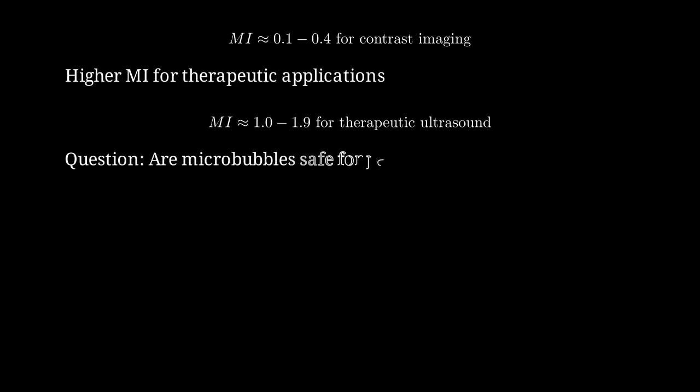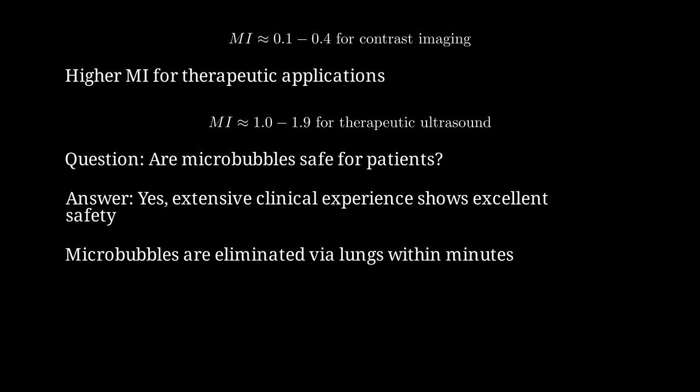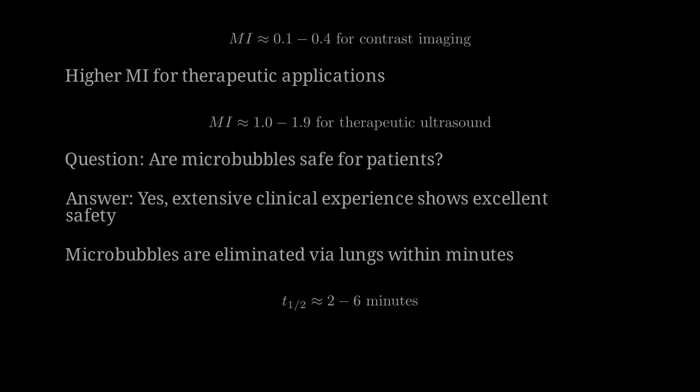An important question: are microbubbles safe for patients? The answer is yes. Decades of clinical use with millions of patients demonstrate excellent safety profiles. Microbubbles are rapidly eliminated from circulation via exhalation through the lungs within 2 to 10 minutes. The circulatory half-life is approximately 2 to 6 minutes, minimizing exposure duration.